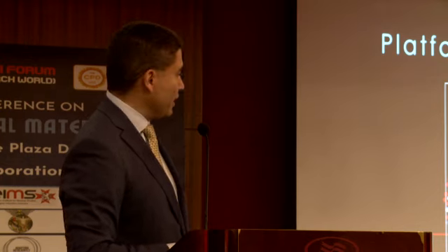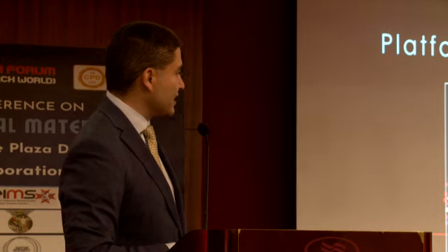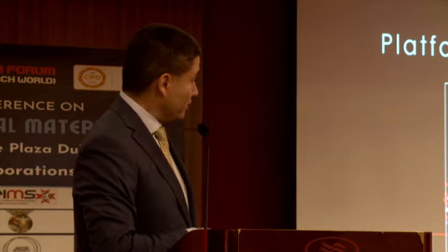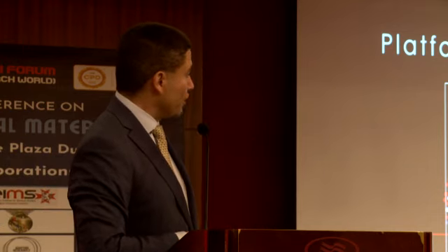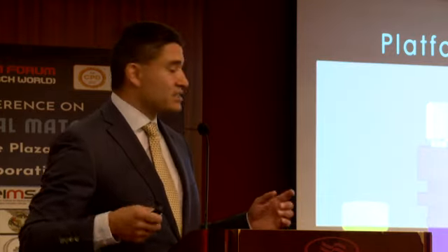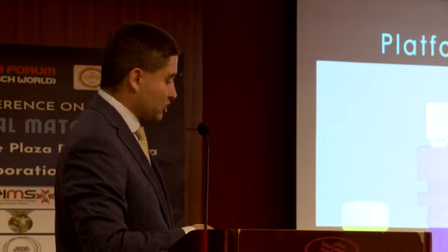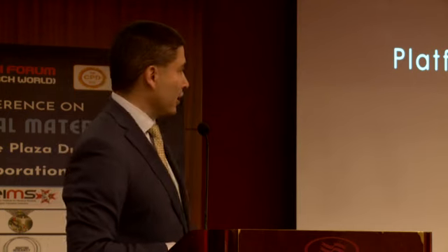So if you already have the platform shifting design, you should use a system that has a concave profile in here, as you mentioned this morning, so you have more soft tissue that is then helping you to protect that biologic width, and that should carry all the way through all the restorative components, from the healing abutment to the final abutment, right?